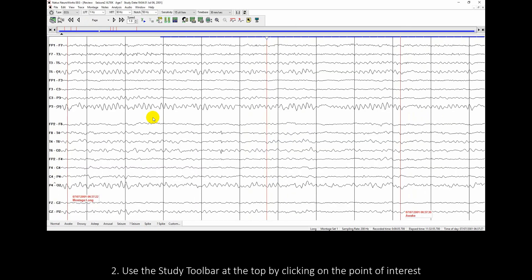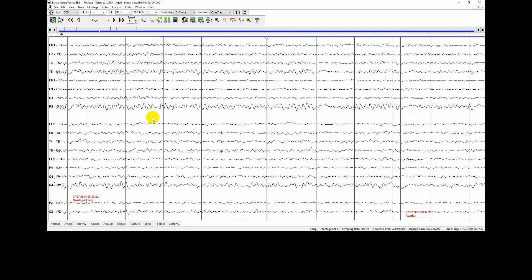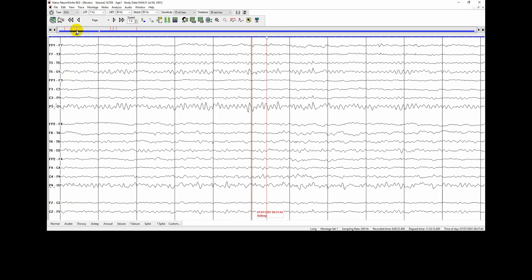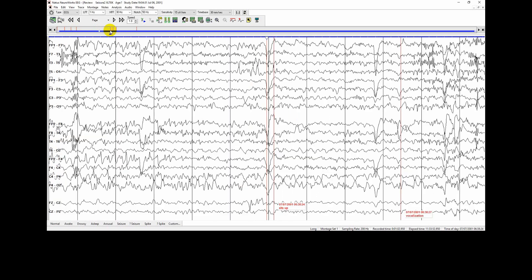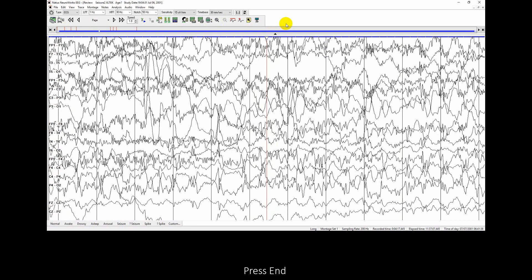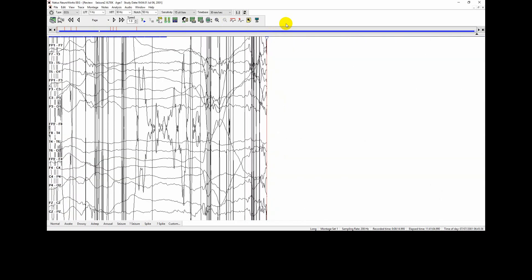Use the study toolbar at the top by clicking on the point of interest. Select End or Home on the keyboard to move to the end or the beginning of the study. Press End, then press Home.